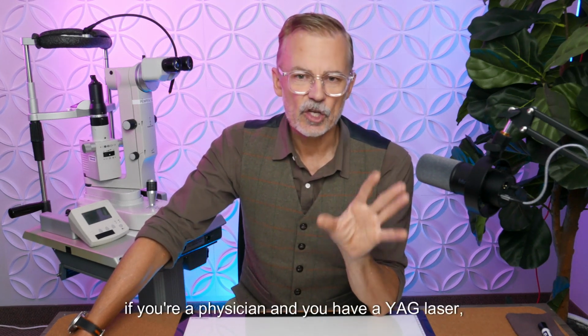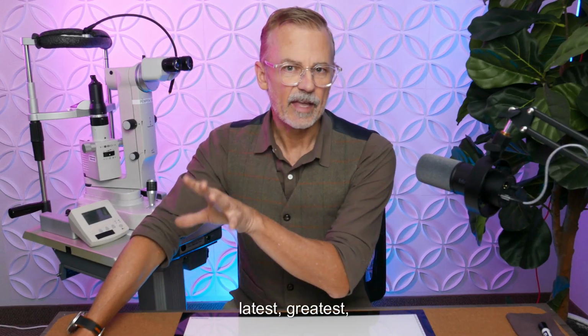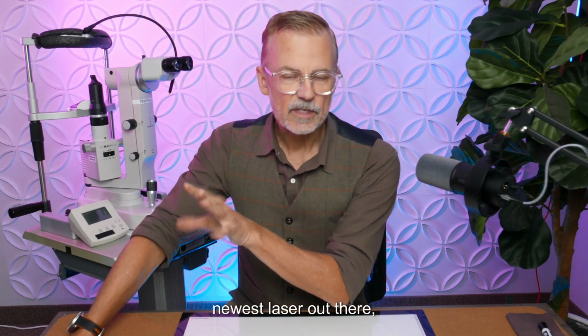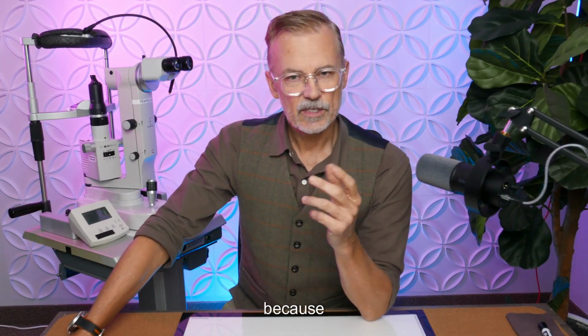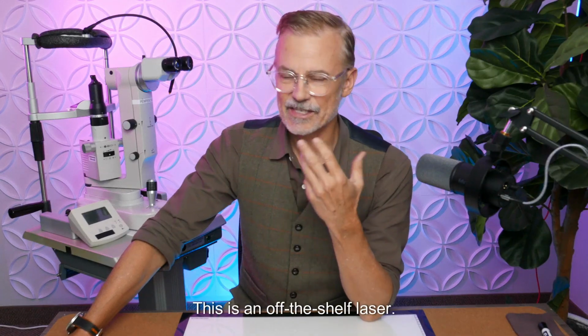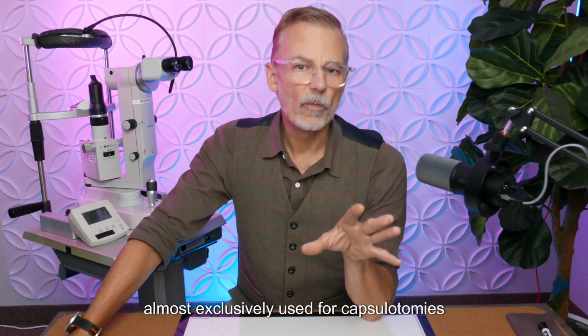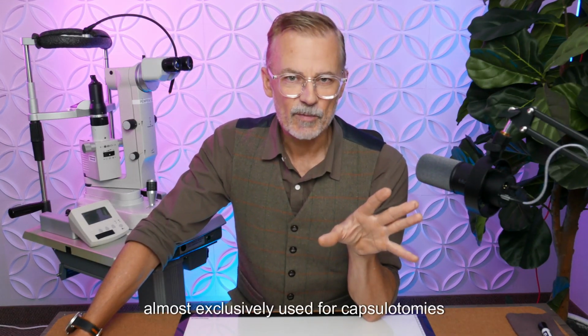So if you're a physician and you have a YAG laser, you don't need to necessarily have the latest, greatest, newest laser out there, because these lasers are not designed for treating eye floaters. This is an off-the-shelf laser. These lasers are almost exclusively used for capsulotomies after cataract surgery.